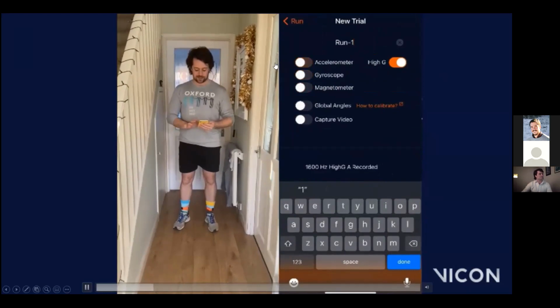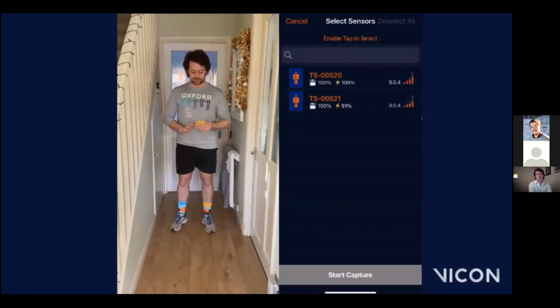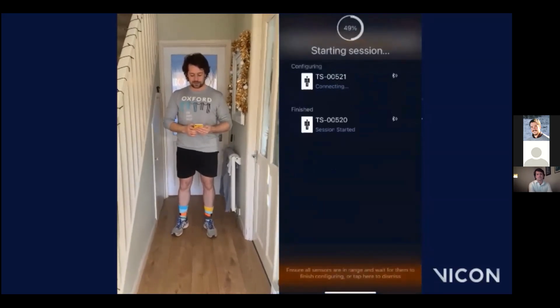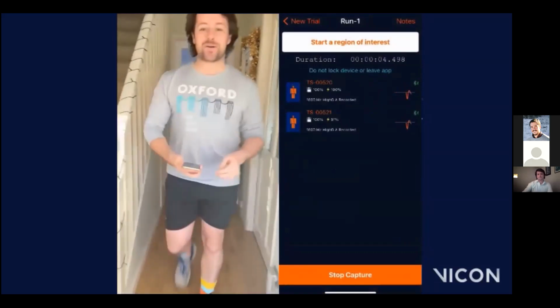Start the capture. This is where you can then select your sensors. When you click Start Capture, the sensors connect to your phone, and we are ready to start the session. So I'm going to go out for my run now.